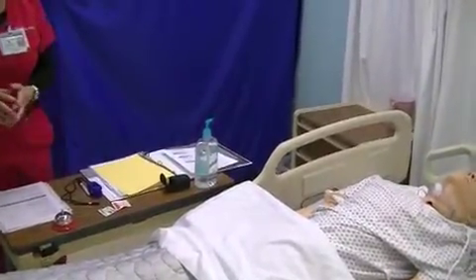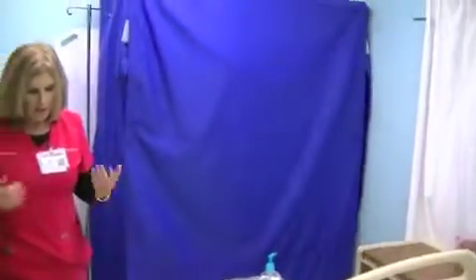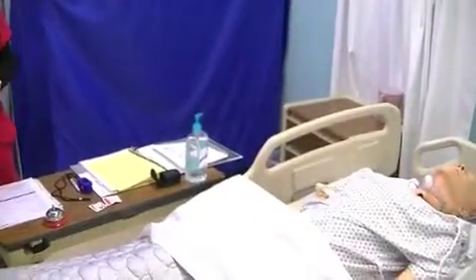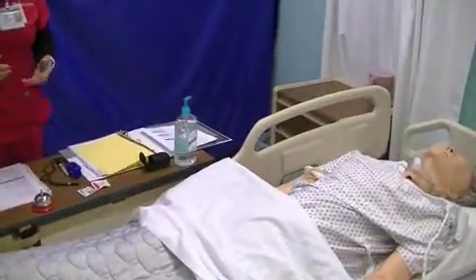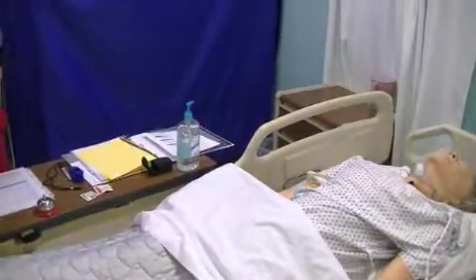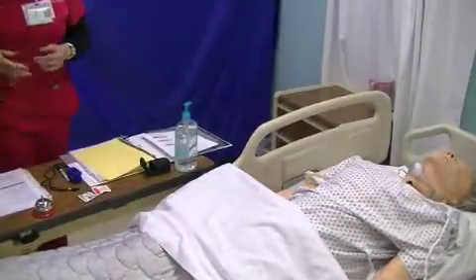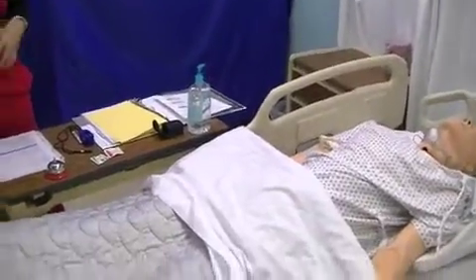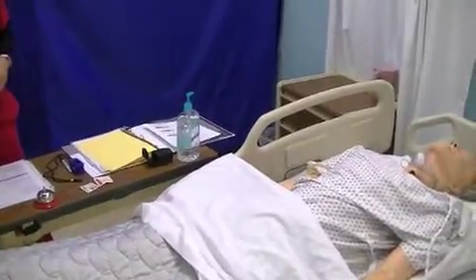Also, before we do this, we want to assess the patient's respiratory status that you learned in health assessment, to check the breath sounds anterior, posterior, and laterally. And also we're going to look at the respiratory rate, depth, and pattern to see how the tissue perfusion is going. We're going to look at the patient's lips, the mucous membranes, and the nail bed color. If the nail bed color is blue and their lips look blue and cyanotic in color, that means the patient has a decrease in O2 saturation.